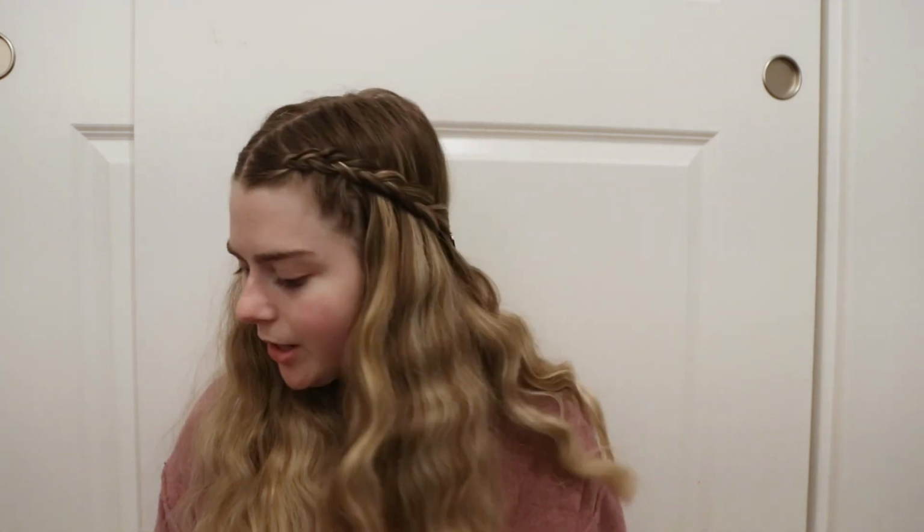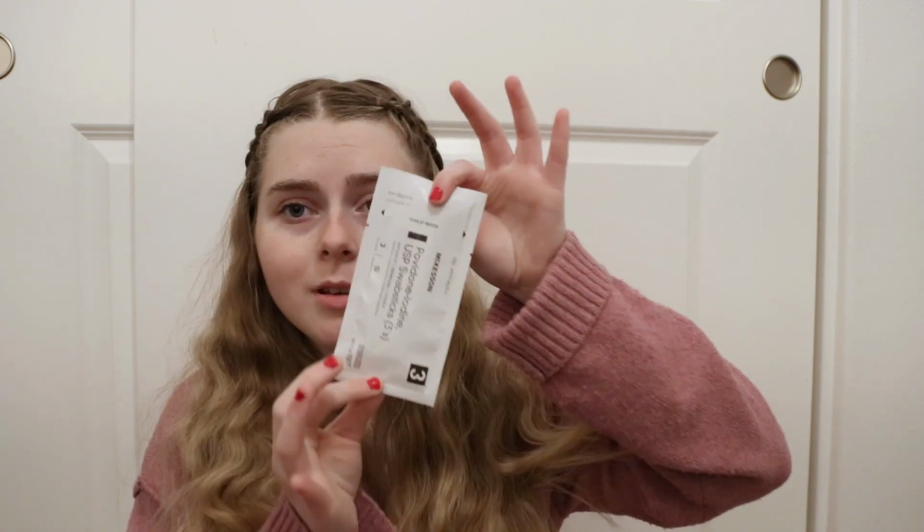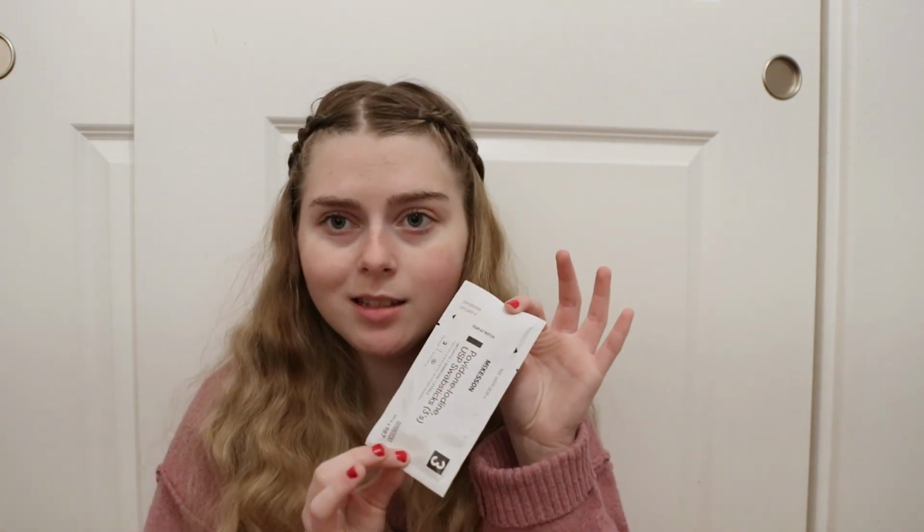And I just realized I breezed through the cleaner and didn't tell you what I use in its place. So in chlorhexidine's place, I will use betadine. And yes, if you are familiar with betadine, it is orange and obnoxious, and we call it my Oompa Loompa stain every time I get a dressing change, but it is so worth it because I do not have any issues with this at all.